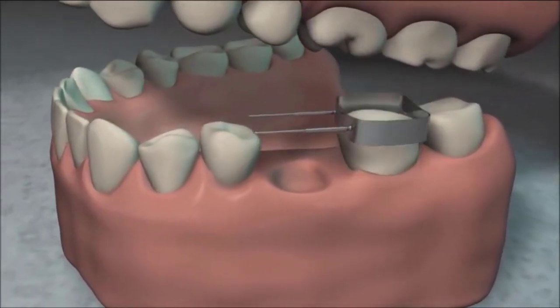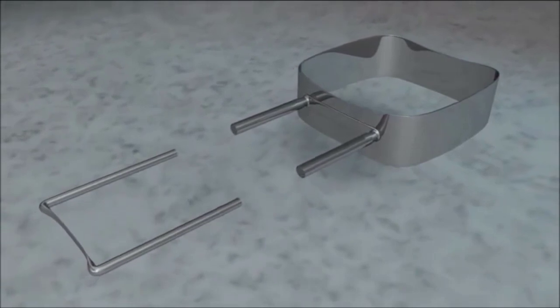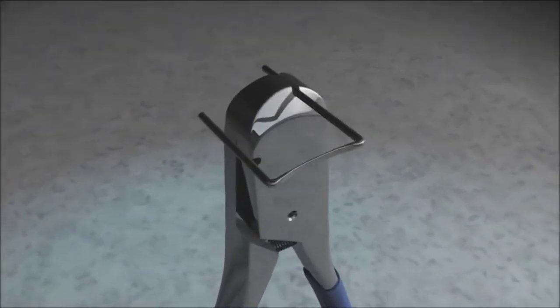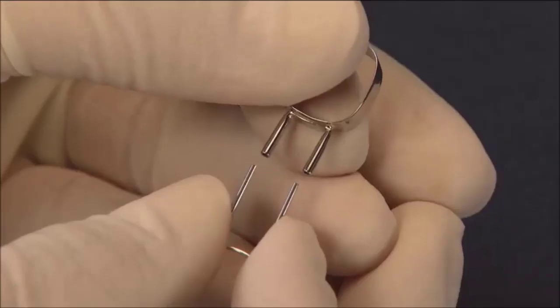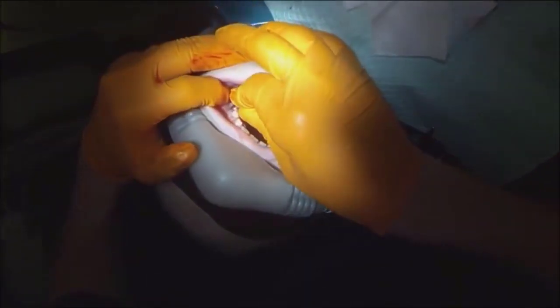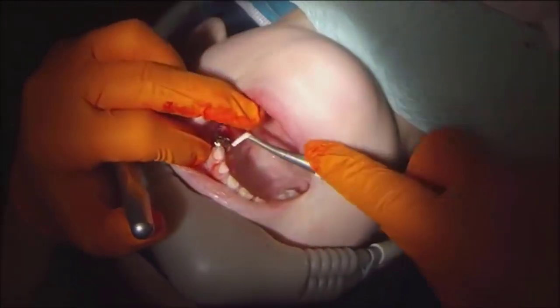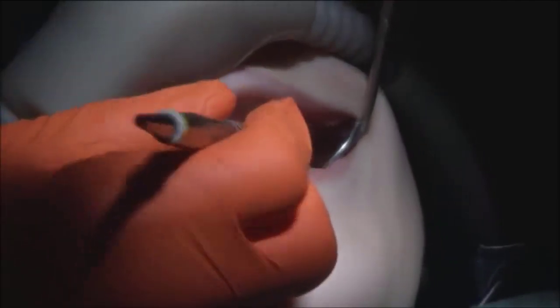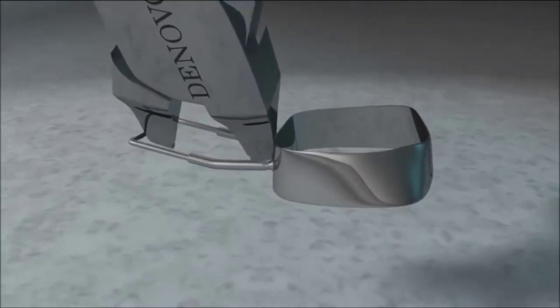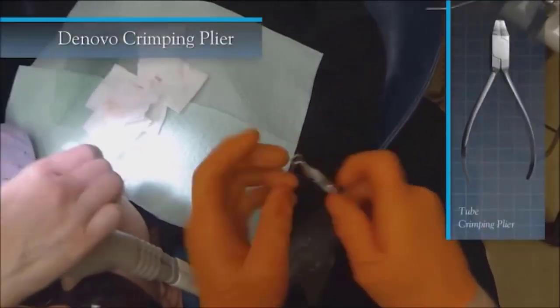Insert the selected wire into the tube of the band and place the band back on the tooth just enough to confirm the wire is at the proper length. If the wire is too long, remove it from the tube and trim the excess using the De Novo wire shear — lay the wire flat into the slot on the shear and cut both sides to make the length as even as possible. Once cut, place the wire back into the tube and try it on the tooth again. If correct, seat the band fully and have the patient bite down using the De Novo bite stick. Check for any gaps between the wire and the adjacent tooth using an explorer or hand instrument.